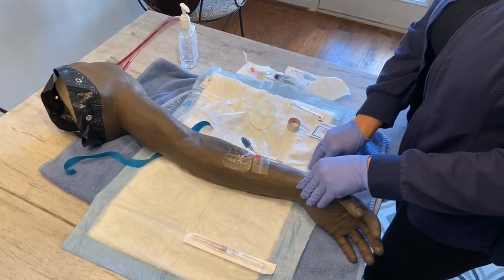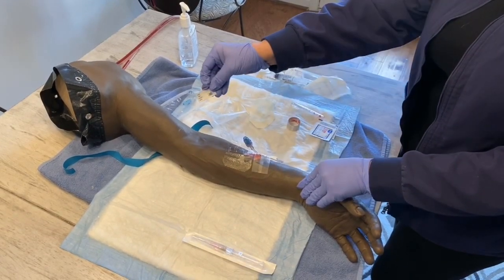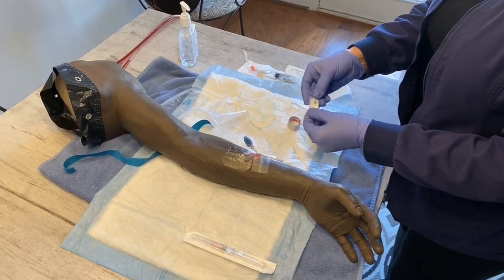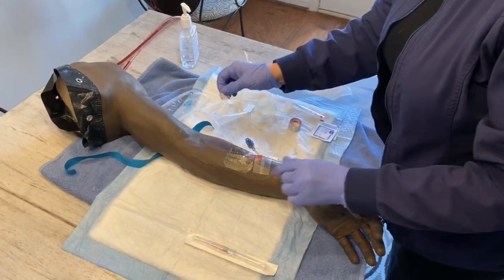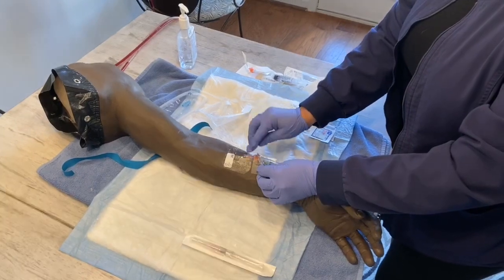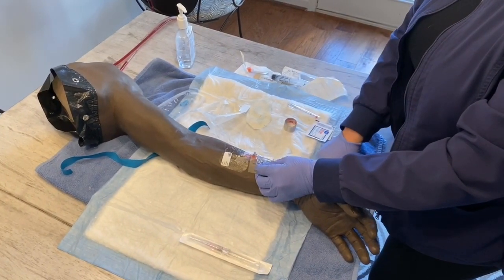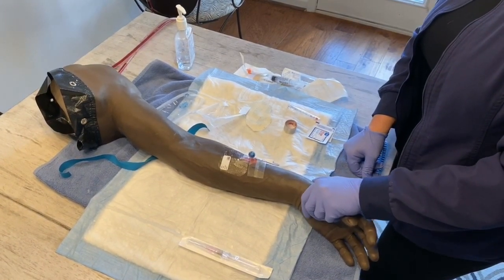Then once you're done, you want to make sure that you always date, time, and label. I like to use the one that comes in the kit. And once I've written on that, I will go ahead and put it on top out of the view of the actual site. So every time I assess the patient, I can see where I've inserted and what the site looks like. I hope this video helps you put in a peripheral IV.